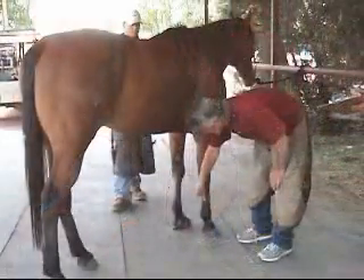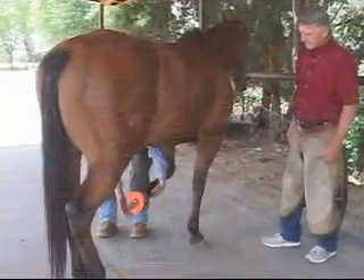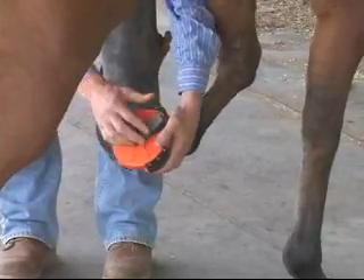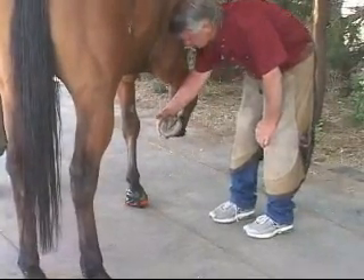The thing that seemed to be the most rewarding part of this was you ask the horse what they really, truly feel, and that was a missing link with him. We put the leverage boot on him. He said, I don't like this at all, and that really surprised us. And of course, a horse that turns circles, that's a big deal. But the thing that was really impressive about it was that we switched the dial to the other side, and he said, this is what's going to make me happy. And so we've given him that, and he's maintained his soundness now for well over a year. And he's run — he's a great horse. People around here say, when Archie comes to town, you're going to have to take second place.